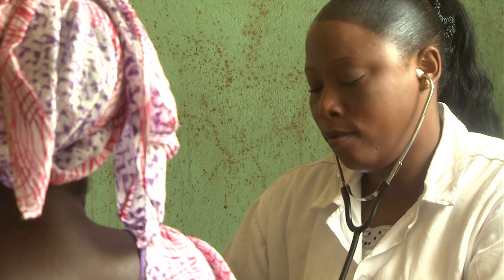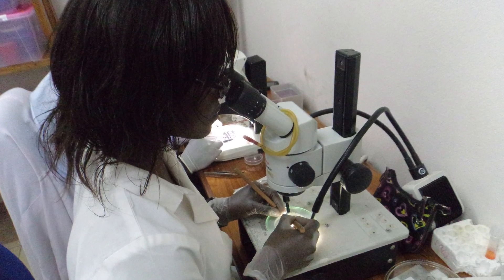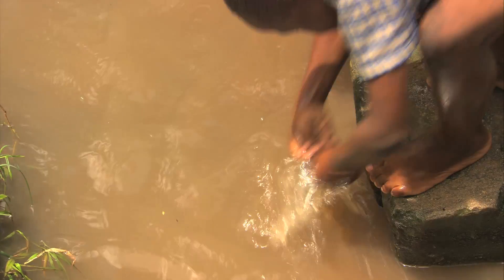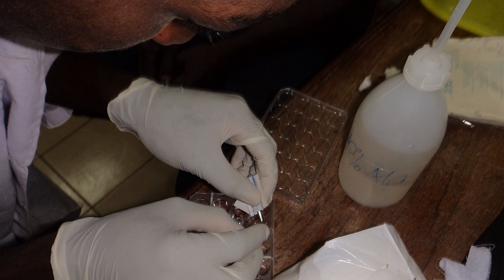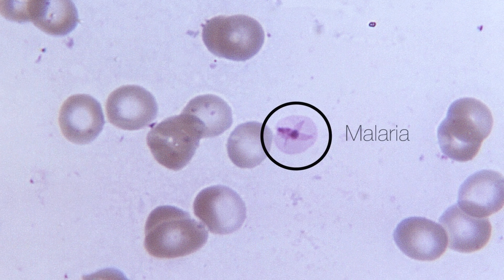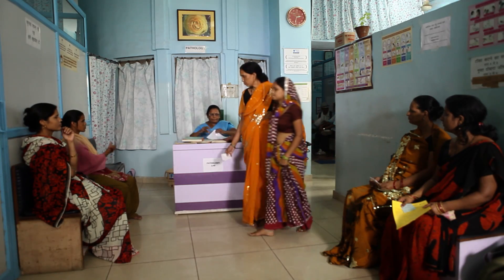A health care worker by themselves cannot do magic and tell you what disease you have. Microscopy is a core tool in health care. Many diseases are caused by microscopic organisms that you cannot see. If somebody had a microscope right there, they would prepare the sample — it could be urine, it could be stool, it could be saliva, most likely it's blood — and then they would look into the sample to find that disease or not. A majority of the world lives in conditions where it's not so easy to just have access to diagnostic tools. People don't actually get diagnosed at all because microscopy as an infrastructure does not exist in the world.